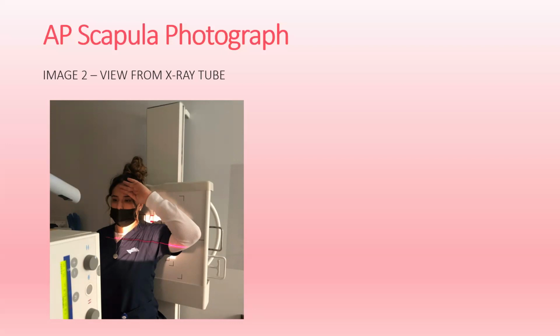The collimated field size is 1 to 2 inches above the skin of the shoulder, and palpate the inferior angle of the scapula to make sure it is within the light field. The kVp range for the real patient is 70 kVp. The instructions to the patient for exposure: you will ask the patient to hold still but to breathe normally.